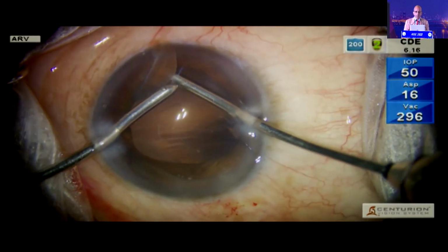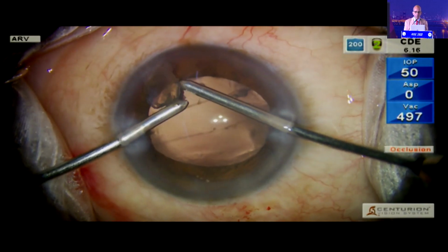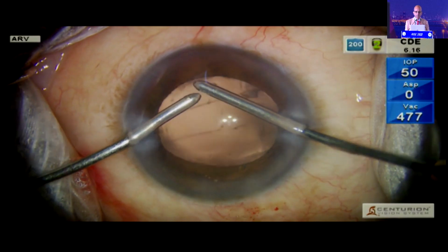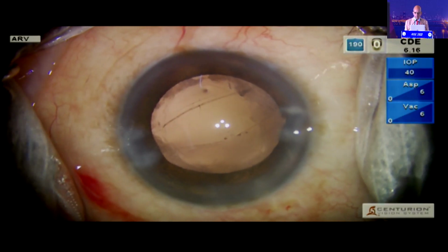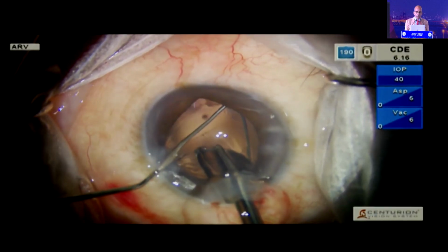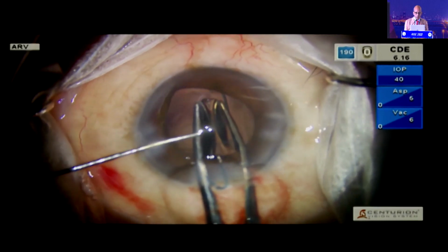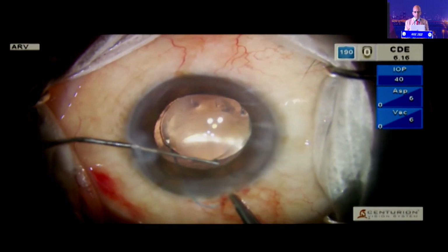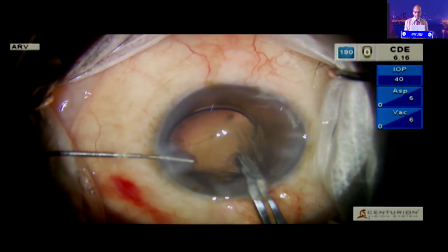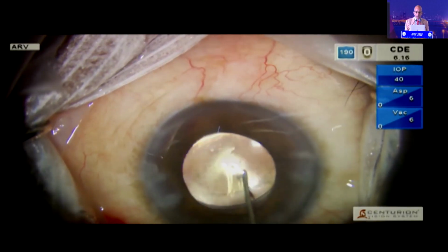So far we are lucky, but anytime vitreous can prolapse. Notice the IOP has gone up to 50, that is a 64 centimeter bottle height, because now I want good pressure on the exposed vitreous face, and I was lucky that it went on okay. Now, I would prefer a 3-piece IOL when the posterior capsule is open, and you can utilize a 3-piece, sometimes capturing it through the opening, or putting the haptic in the ciliary sulcus and having the optic at a different plane. So you can do that.